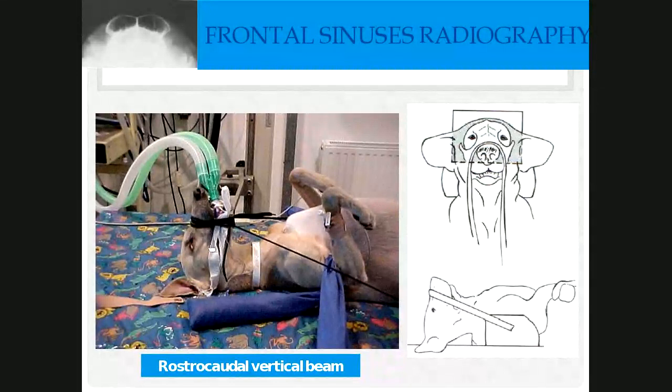The MAS needs to be reduced by 50%. This is because the frontal sinuses are air-filled, and otherwise it'll lead to overexposure. One can use positioning tapes and sandbags or even a Perspex box to obtain this view. And at the top, one can see the air-filled, bilaterally symmetrical frontal sinuses with a bony septum and a thin frontal bone covering each side.